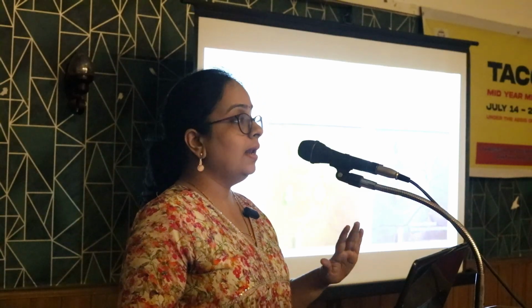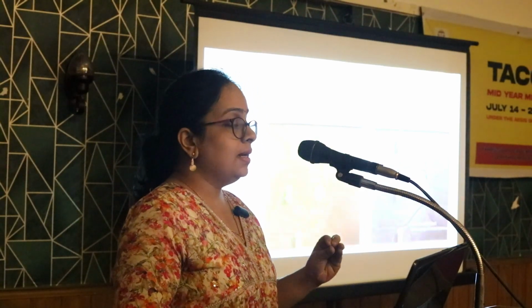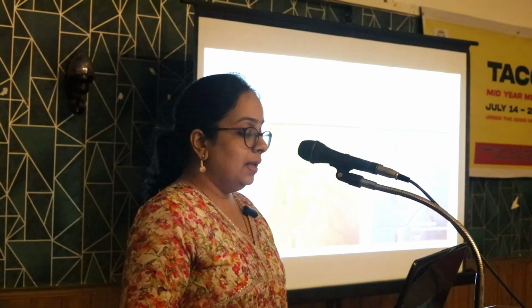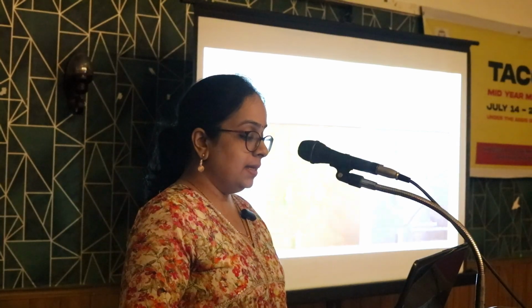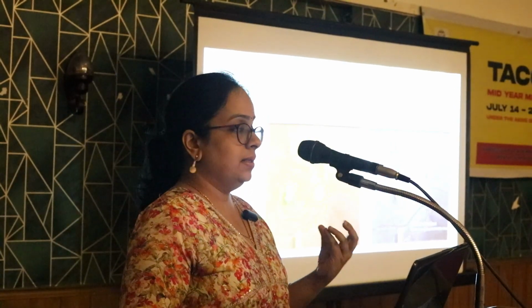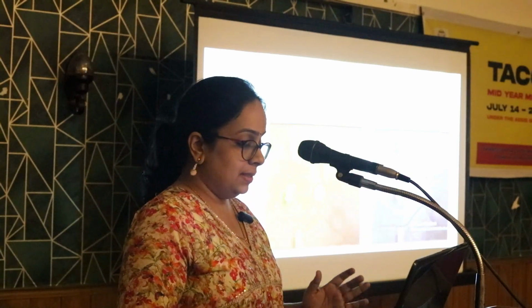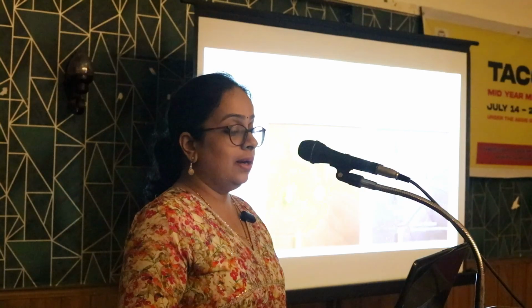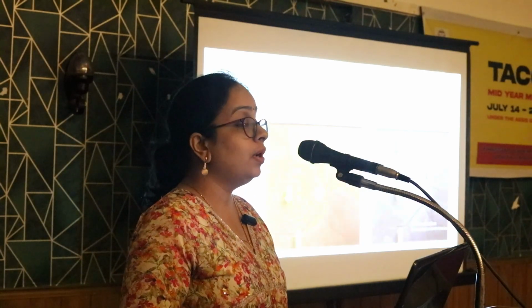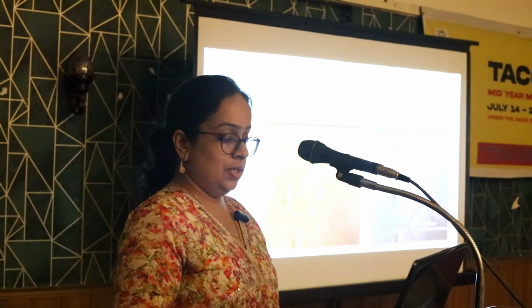Usually, the retinal nerve fiber layer is whitish in color and has a glistening structure. When there is loss of retinal nerve fiber layer, it becomes darker and can have a wedge shape. Like in this case here, there is a wedge shape with darker striations, which is suggestive of a retinal nerve fiber defect. If you have any doubt, you can put on a red-free filter, and it becomes a little more clear, with blackish wedge-shaped striations.